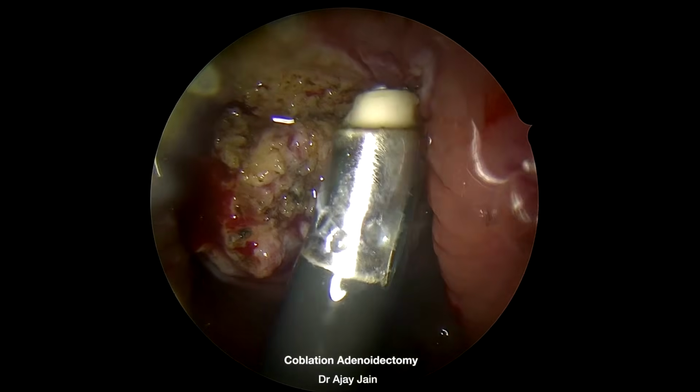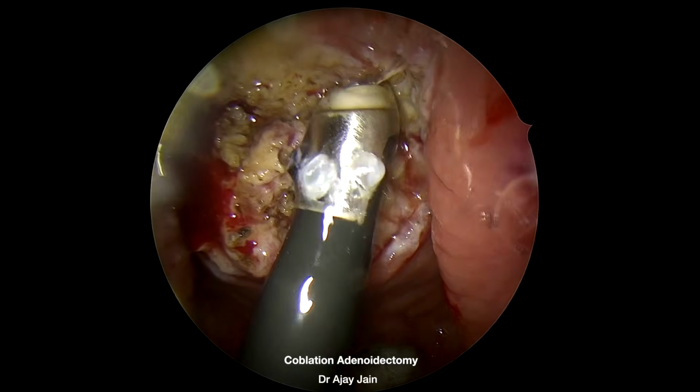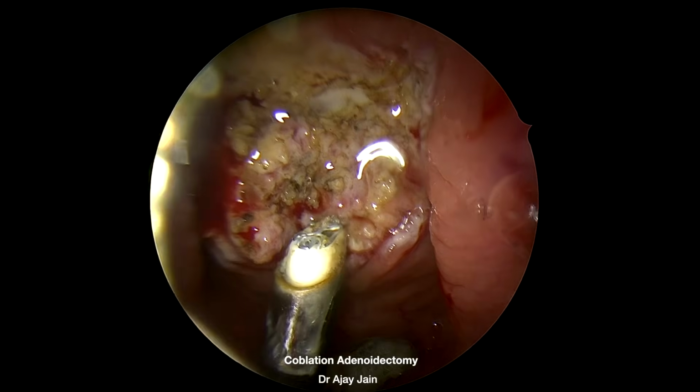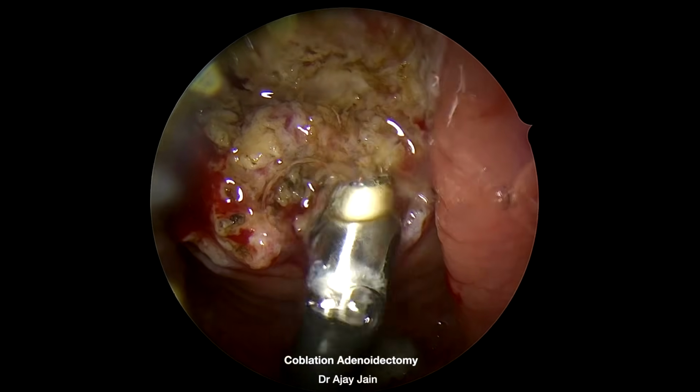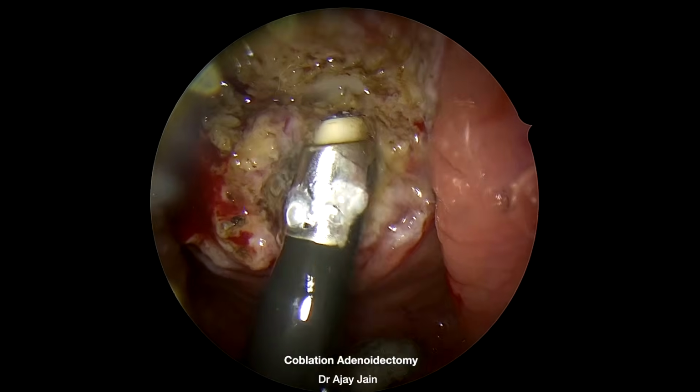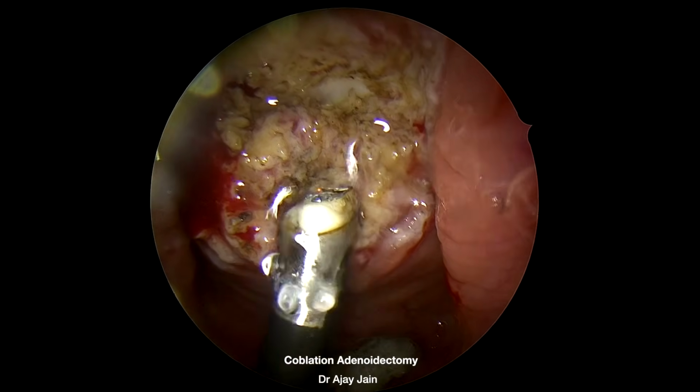When I put the nasal endoscope through the nose, I can directly visualize my wand tip, channels, so it's easier to manage. But when I put both endoscope and the wand through the oral cavity, I can't see the wand tip.